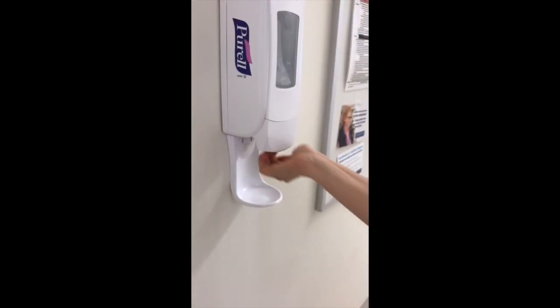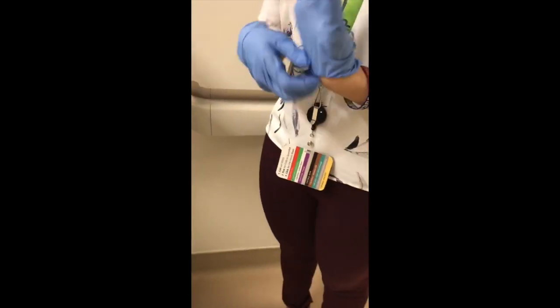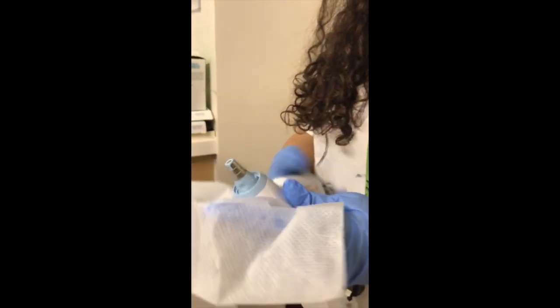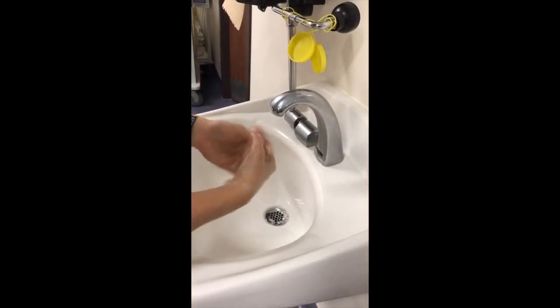Before entering the patient room and putting on gloves, be sure to perform hand hygiene. After performing hand hygiene and putting on gloves, take a PCS 5000 wipe and use it to wipe the thermometer probe as well as the inside and the outside of the thermometer cradle. When finished, be sure to dispose of gloves and perform hand hygiene.